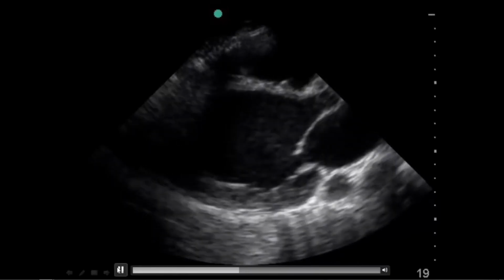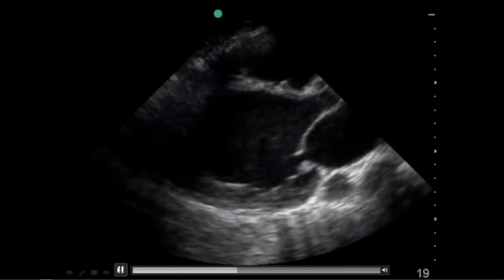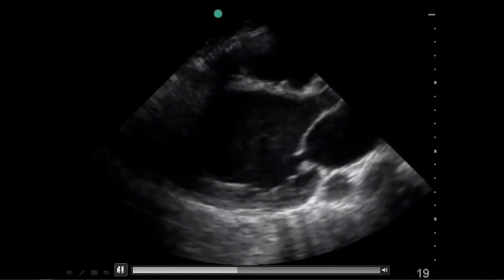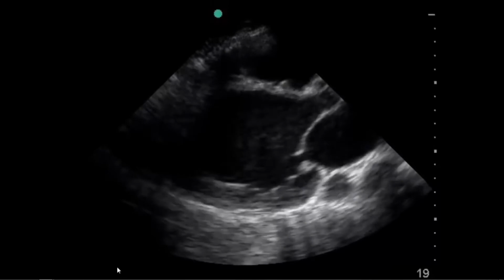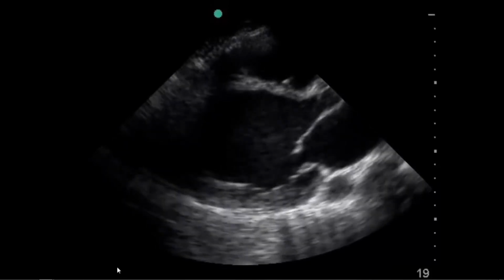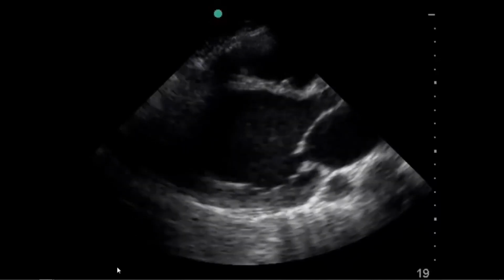And the mitral valve itself here is barely opening. This is the anterior leaflet of the mitral valve. This is the part of the septum that it should be nearly touching. So we see the E-point septal separation in several centimeters as opposed to being just millimeters. So this is very poor contractility that you would see with a patient with congestive heart failure, some of the scarring after myocardial infarction.